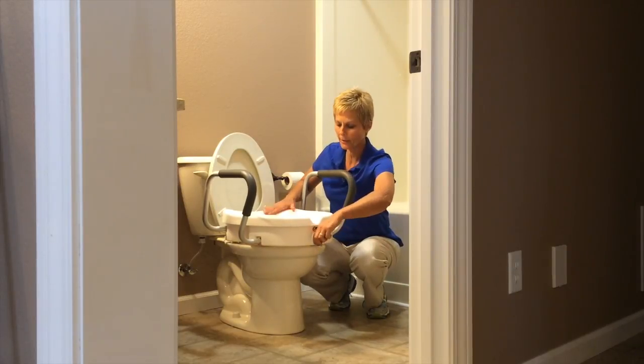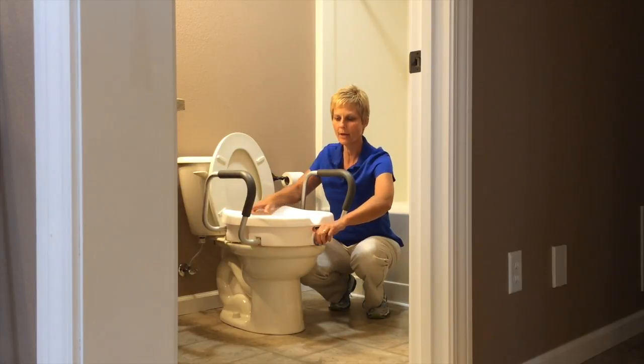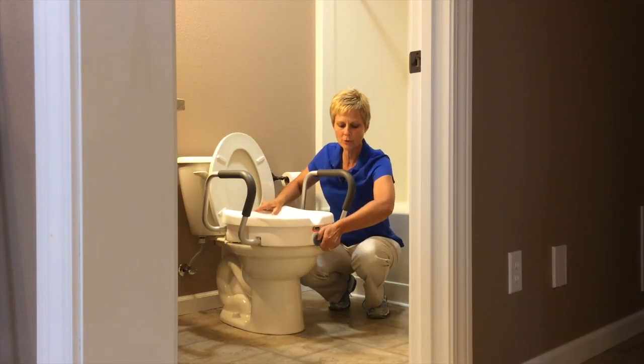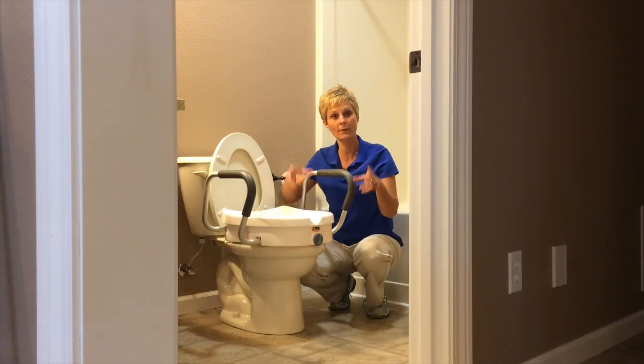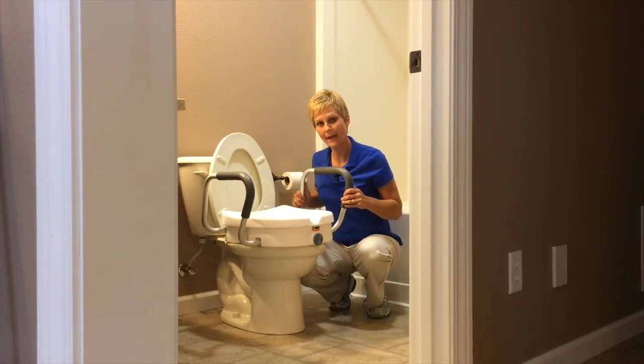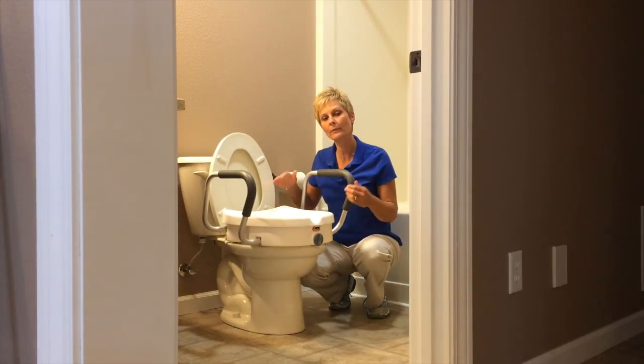Now this particular seat was advertised as a universal seat that would work on a standard or an elongated toilet seat. I would probably try to go with something that's going to fit your exact toilet. This is going to have a little bit of play side to side, so you need to be careful not to put too much pressure to one side when wiping.